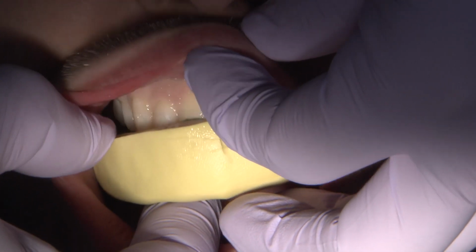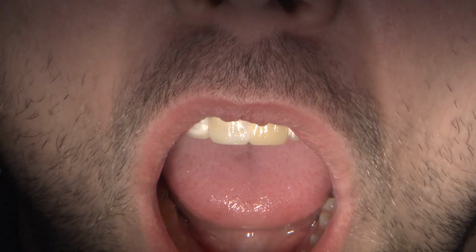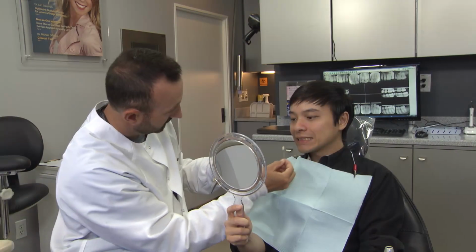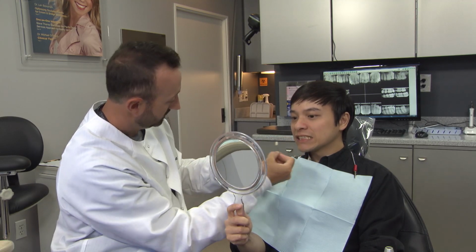This appointment is the best time to use your putty stent to show the patient a simulation of the teeth size and shape, as long as no flared or malaligned teeth prevent the seating of this matrix before preparation. If biotemps are going to be utilized for the temporary stage, this appointment is the best time to pick a shade.